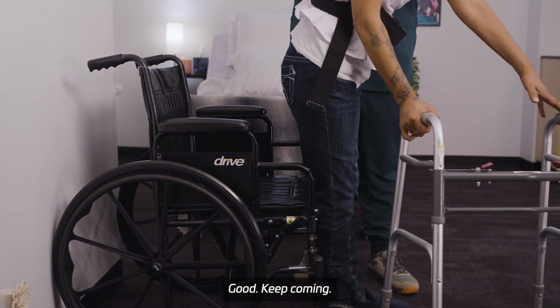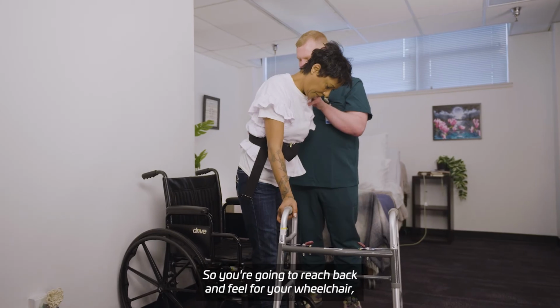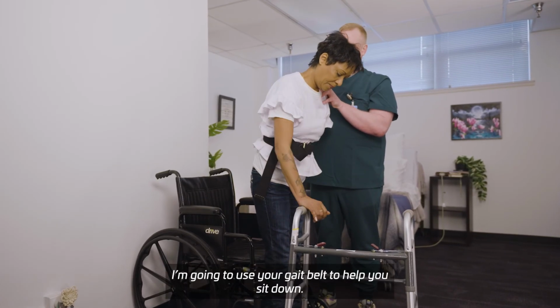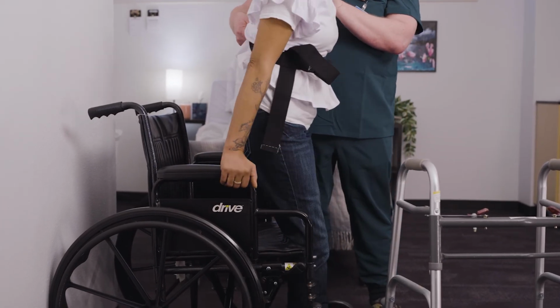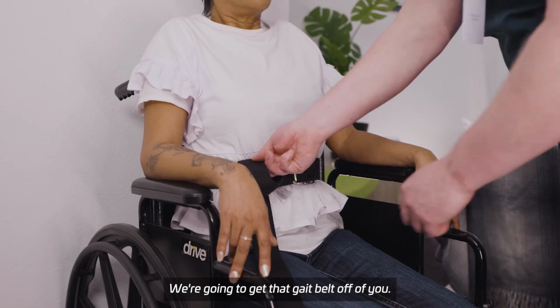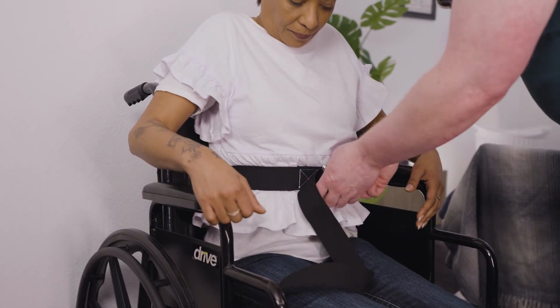Good. Keep coming. Oh, I feel it now. You feel it, good. So you're going to reach back and feel for your wheelchair. And on 3, we're going to have a seat, okay? I'm going to use your gait belt to help you sit down. 1, 2, 3. All right. We're going to get that gait belt off of you. Tuck it.